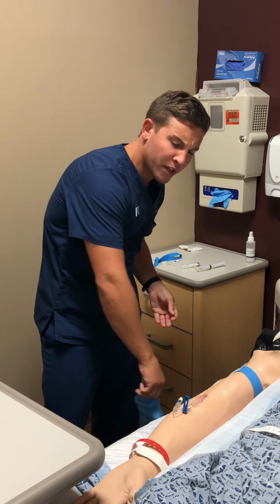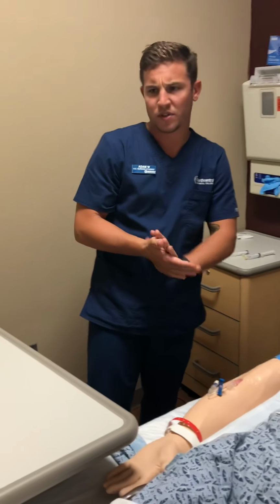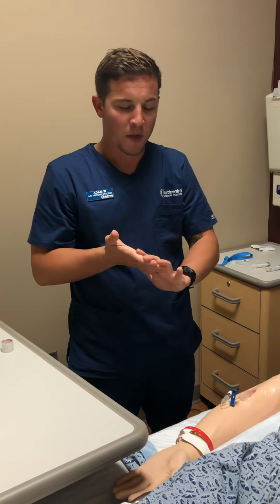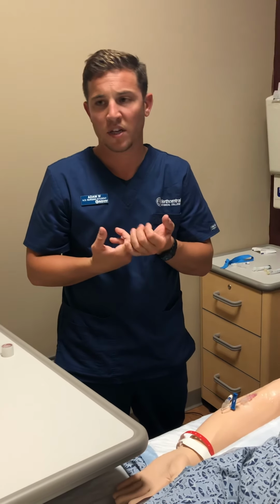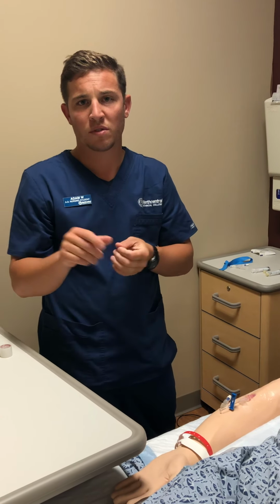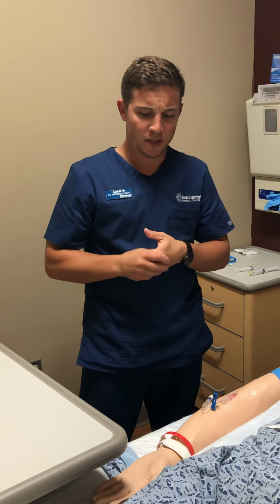and some lifespan considerations here, or some things to note, is that a pediatric patient sometimes has a hard time with needles, so maybe having their parent with them would help calm them down. If you have a geriatric patient with real thready veins, you can obviously apply heat to dilate the veins, or if they're real thready, you can use a butterfly needle, which is a lot smaller. So that's some lifespan considerations.